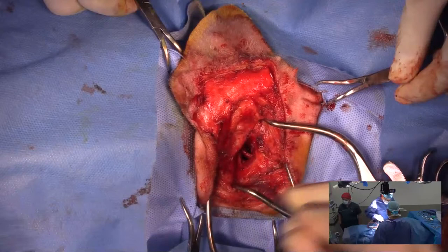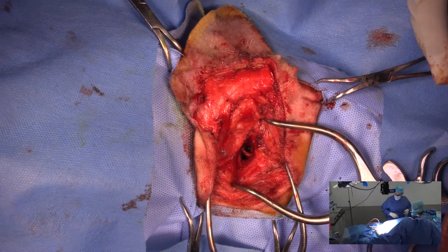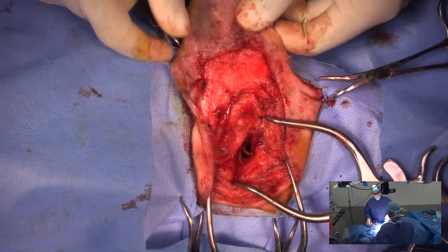I can stick a rongeur. Can I get a medium-sized rongeur? So a Ruskin that's smaller than this. Thank you. And we'll pull that up a little bit. Can you zoom in a bit more?